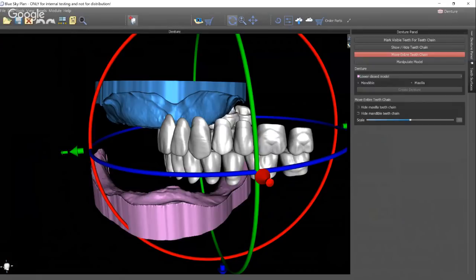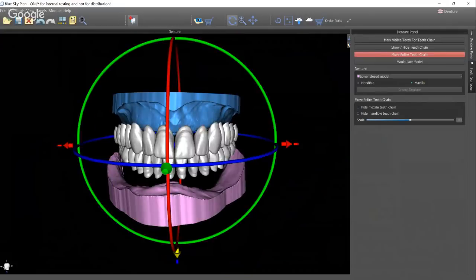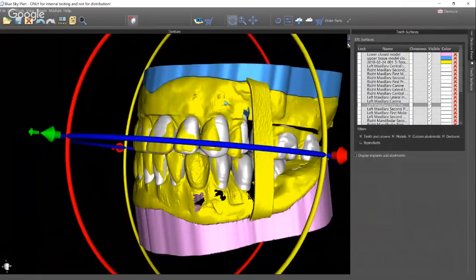Now, you could be doing that with bite rims, and so if you did this more of a traditional way where you had wax rims, hopefully you set the occlusal plane to ideal, and then you're just going to come and set this occlusal plane of these denture teeth to the same plane. In a case like this, I have that buccal bite as a reference. So I can pull these in, get them approximated, and then I can turn on the buccal bite and I can begin relating those to the occlusal plane of the existing dentures. And if I liked the occlusal plane of those, I can more or less match it. That was the case here. I'm basically matching the occlusal plane.